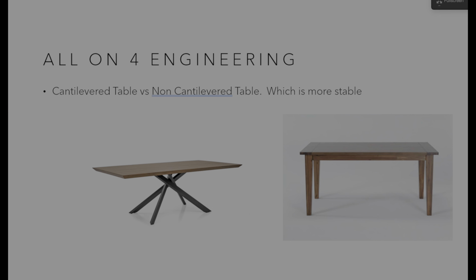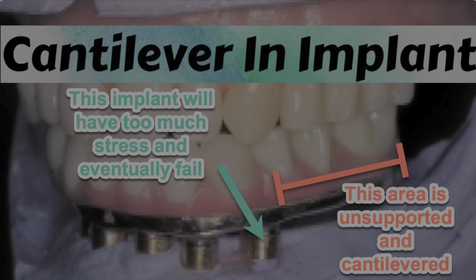It's like the legs of a table: if you put your legs too close towards the center and you push or jump up and down on the ends, you're going to loosen or damage the hardware keeping the legs intact. Similarly, mechanically and physics speaking, you're going to cause issues with your dental implants if they are placed too far up front.